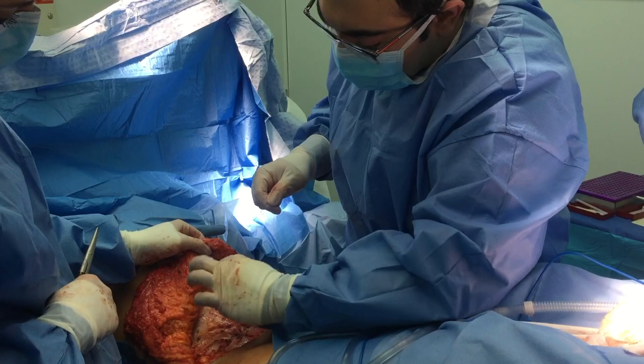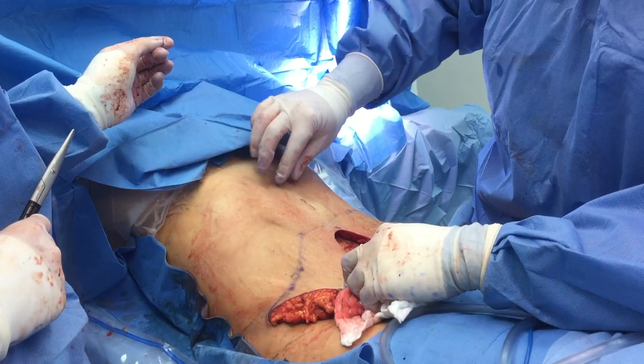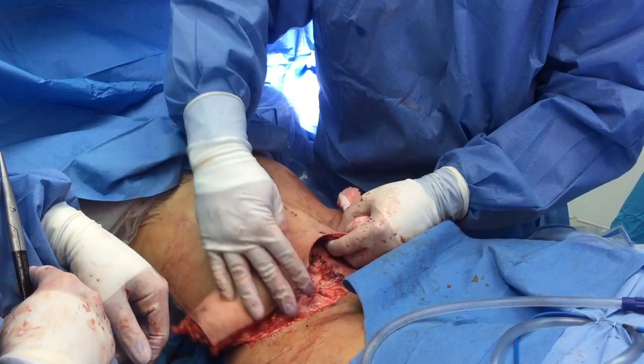We're securing the flap onto the anterior rectus sheath. When we look here anteriorly, even in a very thin woman like we have here, we see a little bit of dimpling — and again, that's going to go away, so no concerns there. Now I'm going to place another row of about three or four sutures. If I were to take my finger and push it through here, I'm very well secured, and you can actually see where those are tacked up onto a nice bite of Scarpa's fascia below.